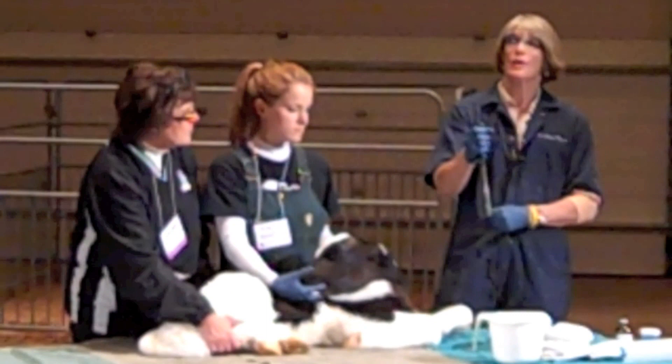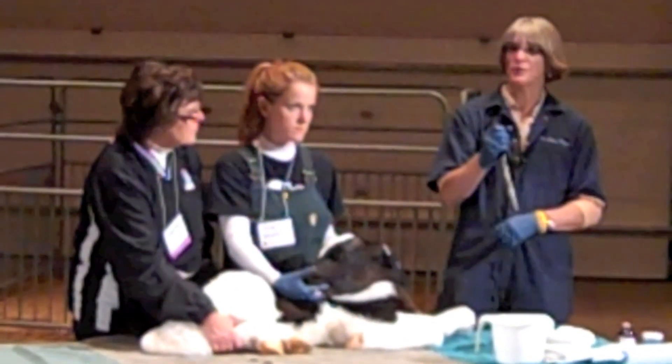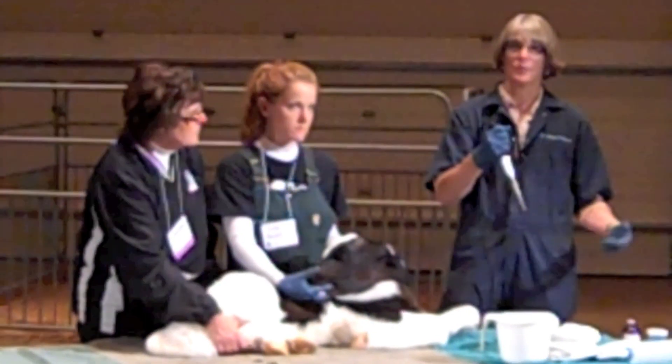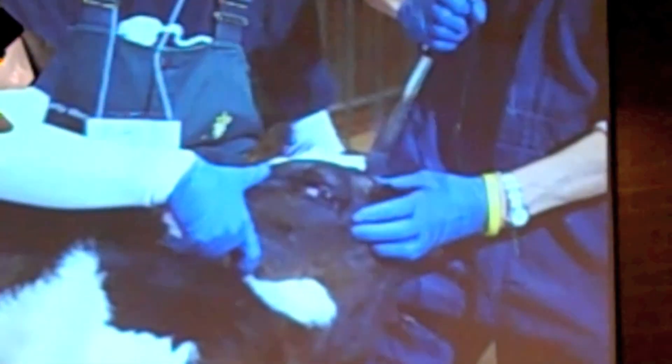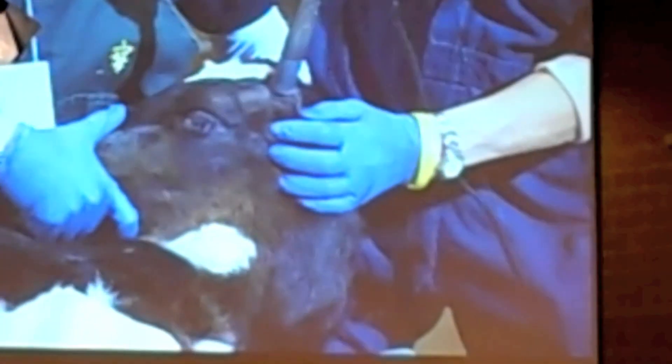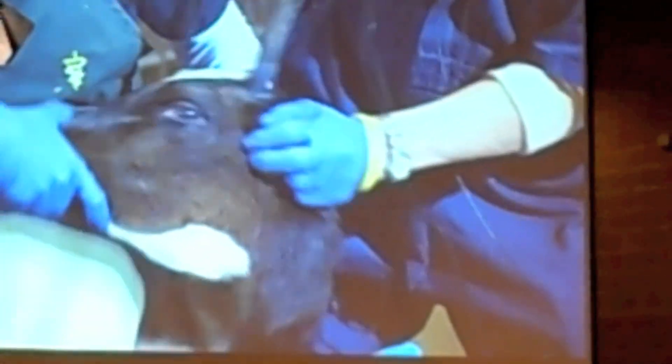I count 1,001 — 1,002 — 1,003 — 1,004 — 1,005 — a slow five-count. I feel the horn bud and go through that full count. Whether due to pressure or an incomplete block, the first side wasn't ideal, but life isn't always ideal.